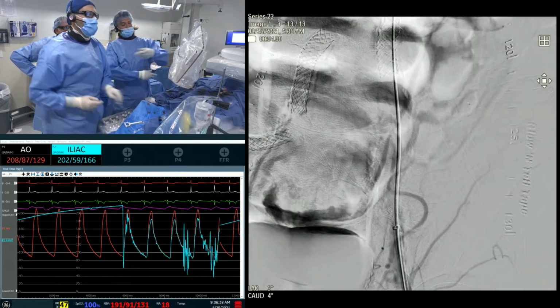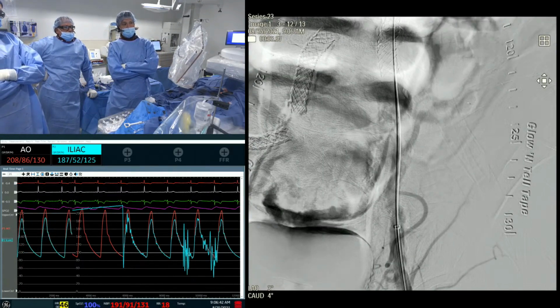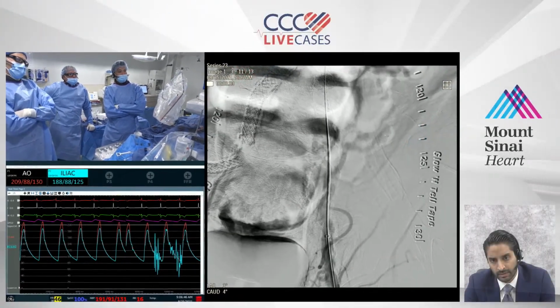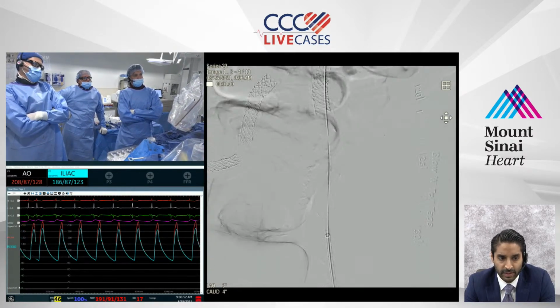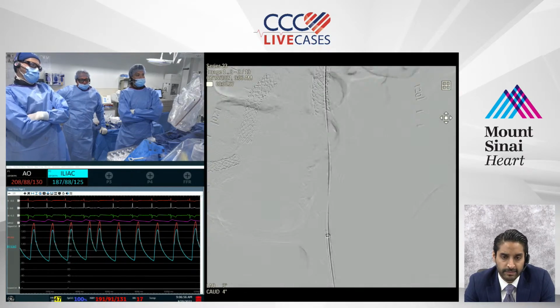I mean, that iliac looks a little strange, but if you're coming back to it, I would probably leave it alone for now. Everybody agrees? It would be another very long stent that would have to extend pretty much all the way back up to where your sheath is. I think we're just going to end up propagating the stent further and further. I agree. So we're done here.